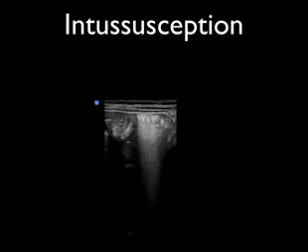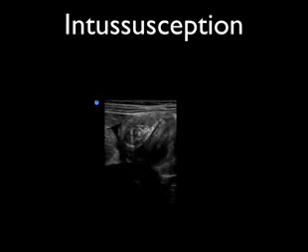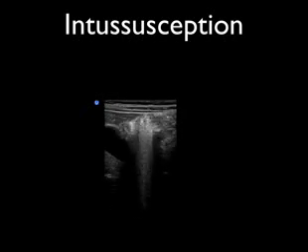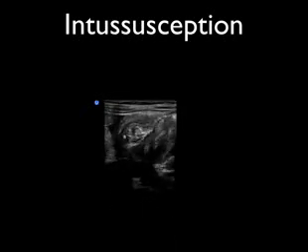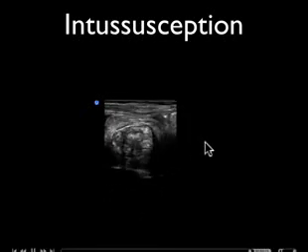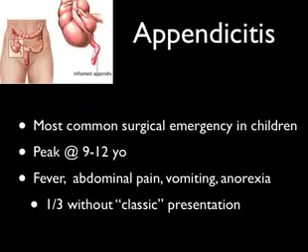This is the actual video of this patient. We're right around the epigastric area, under the liver. We moved it over to the right upper quadrant, and it's where the ascending and the transverse colon came together. We can see the intussusception starting to appear right there. And that's it right there. There's actually kind of a long axis of it right there. Now we're in short at the end of it. So that's kind of what we're looking for.